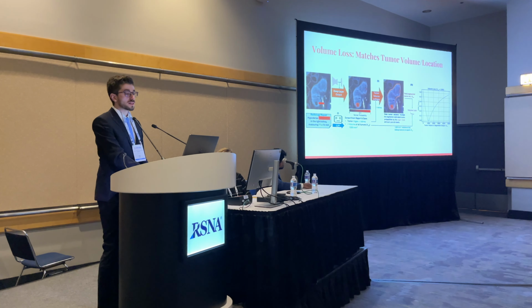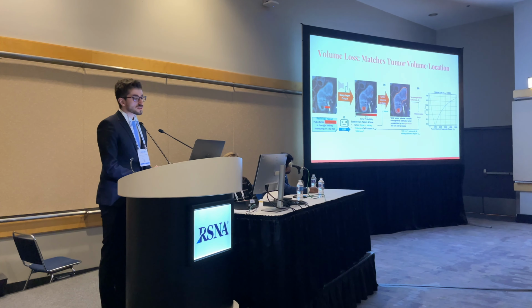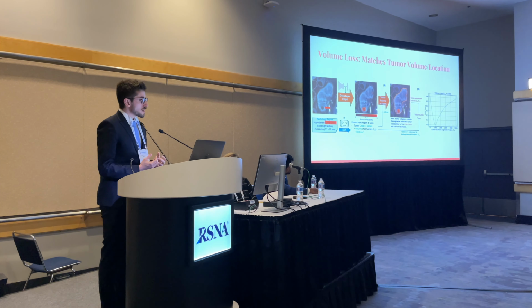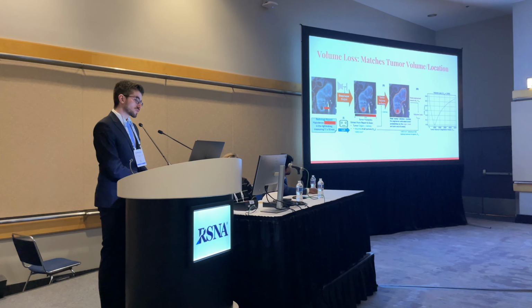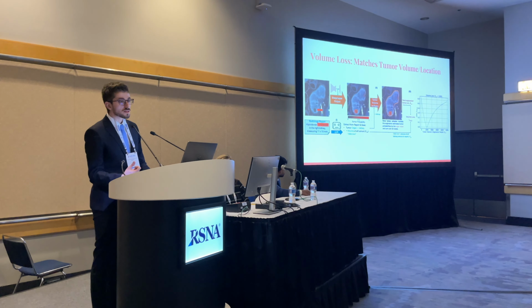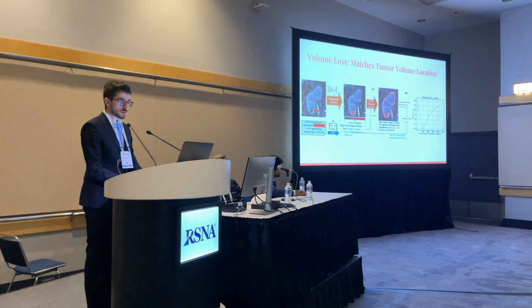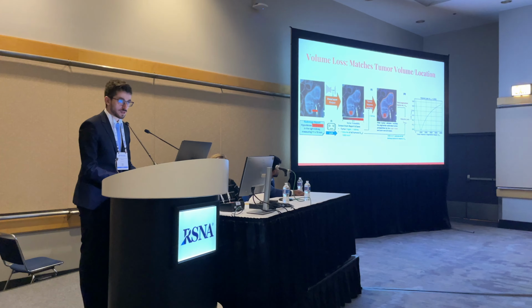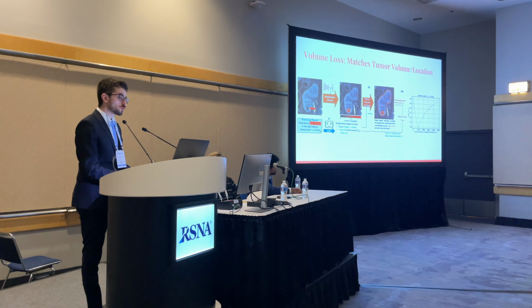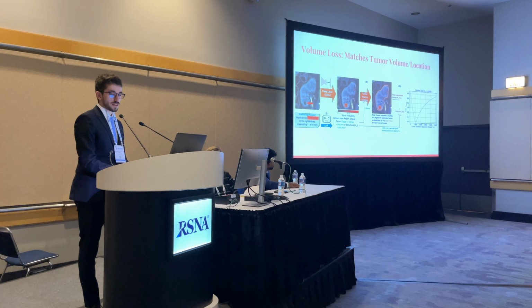The first one is the volume loss. It's a less strict loss. What it does is it makes the model segment tumors that match the volume of tumor that we can estimate from the report. The report does not give tumor volumes, but we can estimate them from the tumor diameters. So for each organ with tumor, we estimate the total tumor volume inside that organ.